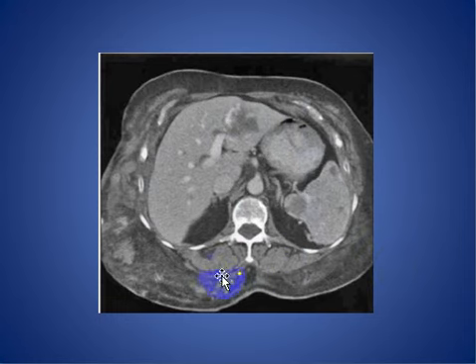Here, in this patient with an axial CT scan after contrast, we see multiple lesions in the spleen and multiple lesions in the liver and also multiple lesions in the subcutaneous tissue. And this patient has thrombocytopenia with multiple hemangiomas and coagulopathy, and the patient has Kasabach-Merritt syndrome.